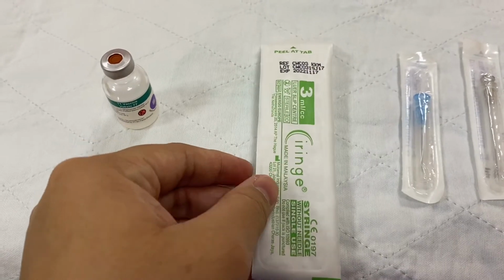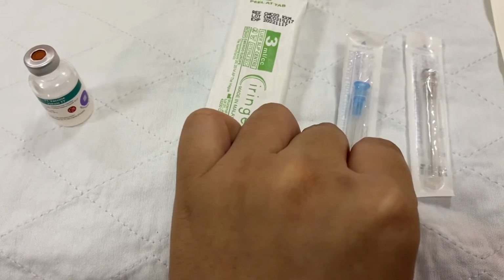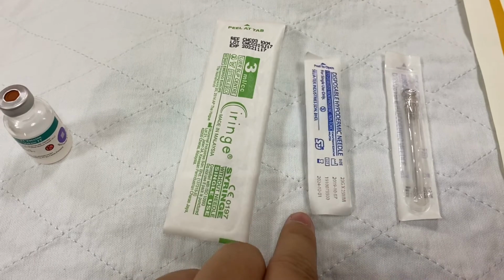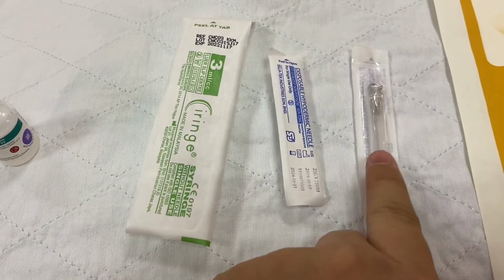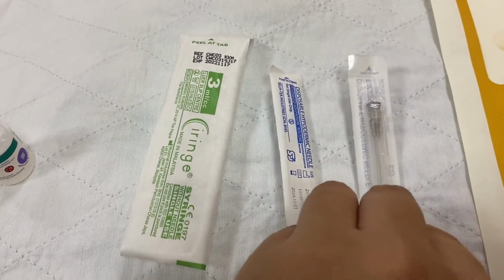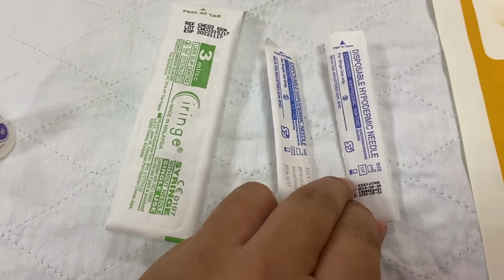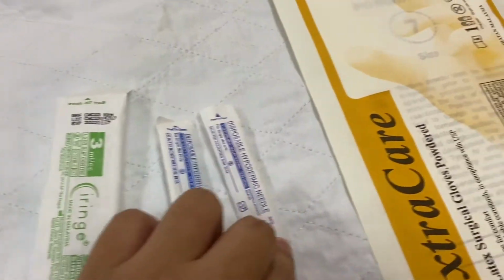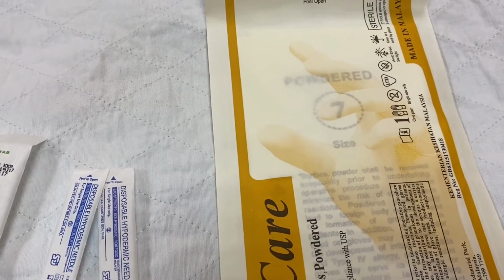I take 3 mils, and this is the needle for injection, size 23G. For drawing the medication out of the vial, we can use a bigger needle, which is 22G size. And then our PPE, the glove.